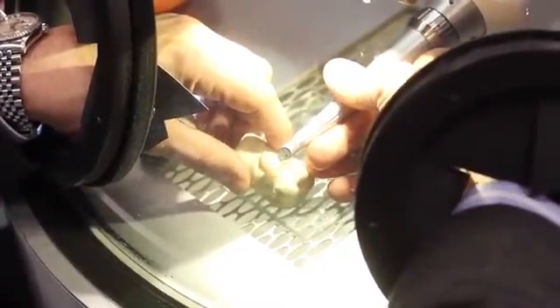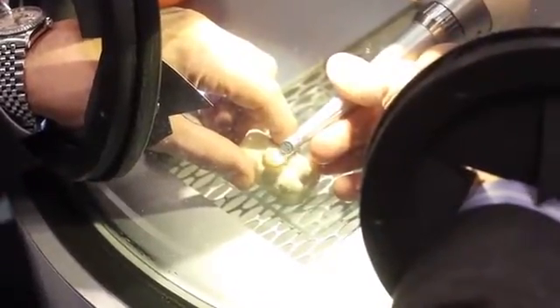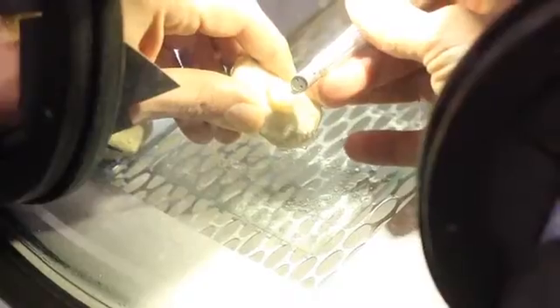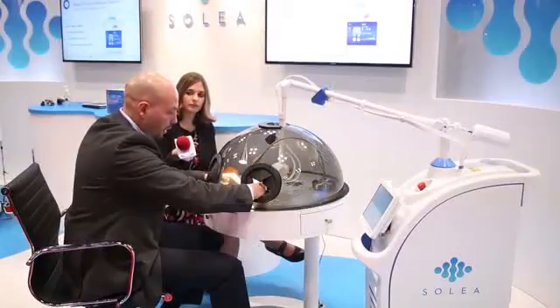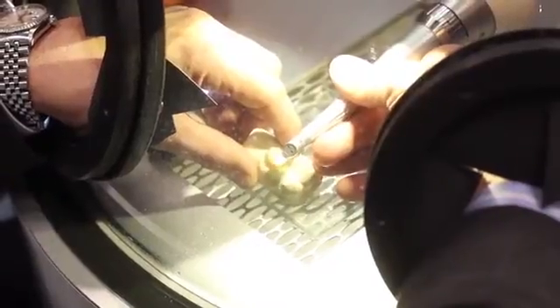What is the patient experiencing right now? So the patient experiences — most of the procedures I do, 95% of them I do without anesthetic. So initially during the first 30 seconds or so, the patient is going to feel just some cold sensation at most. And then they feel more the suction on their tooth, but very manageable. Nothing like biting into a popsicle stick.